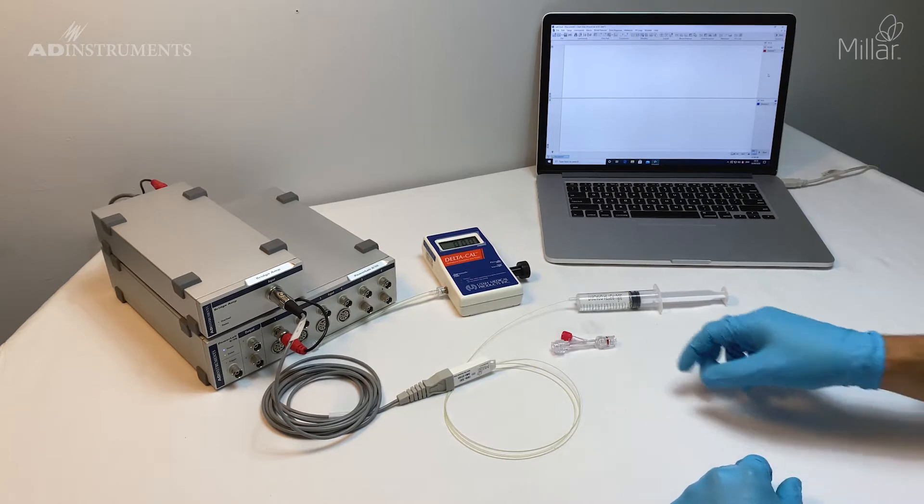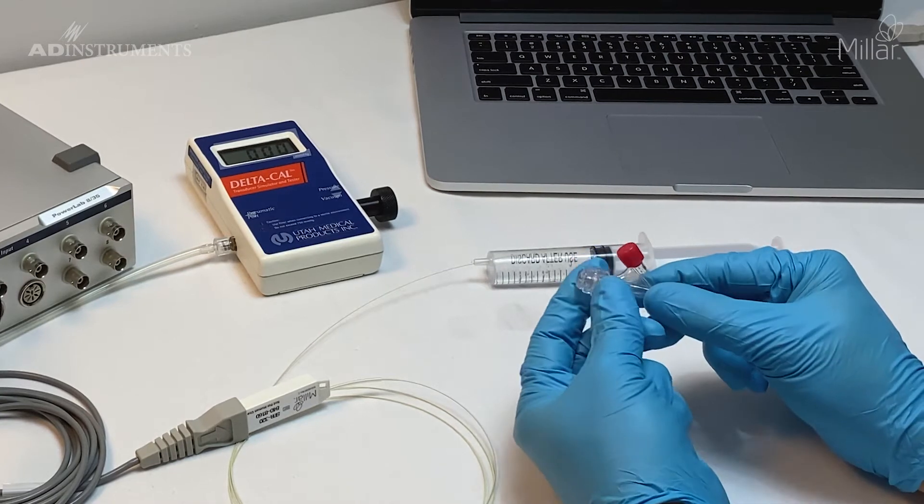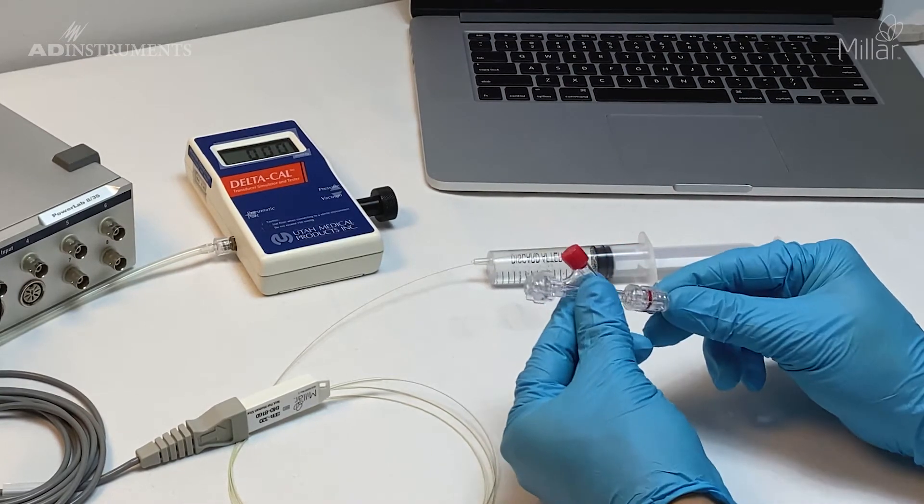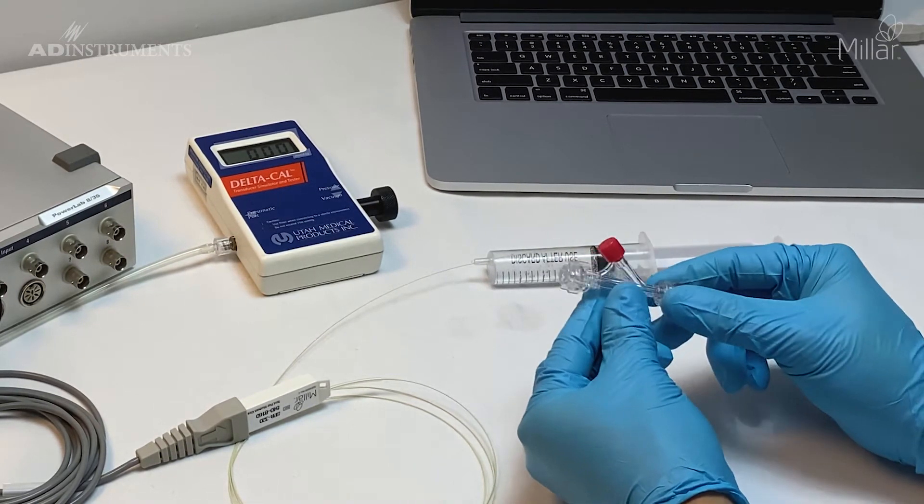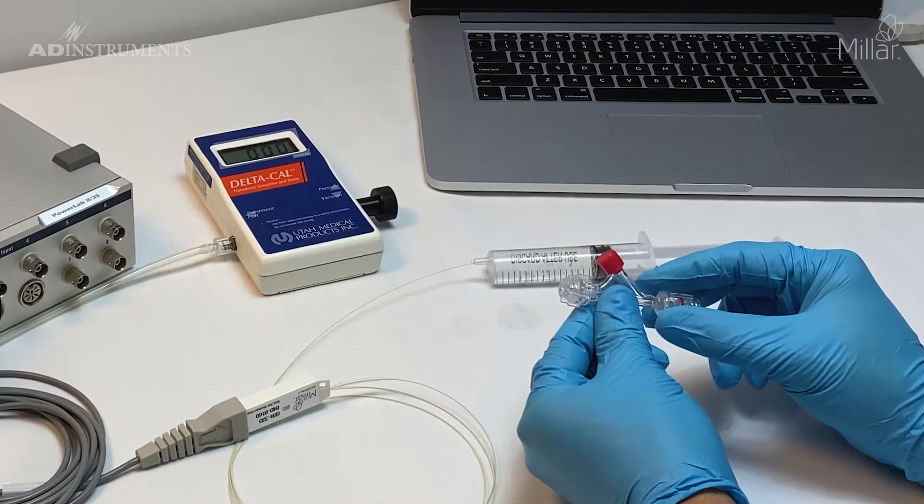To start, I'm going to fill the hemostatic valve, which has a valve on one end and is open on the other end with a cap with a port on top. I'll fill this up with saline first for the catheter.